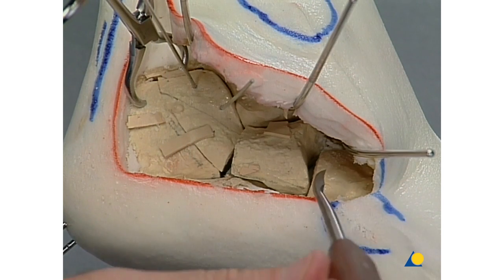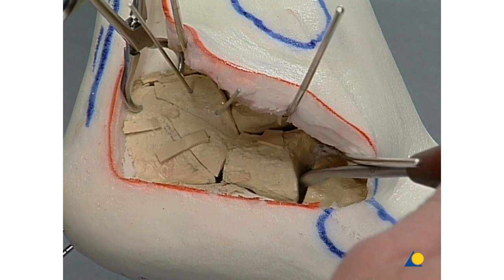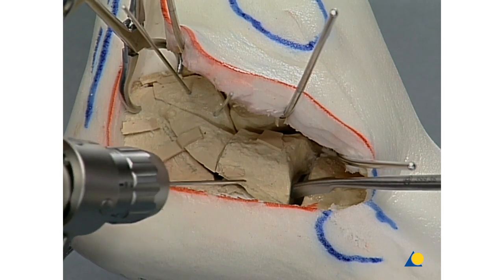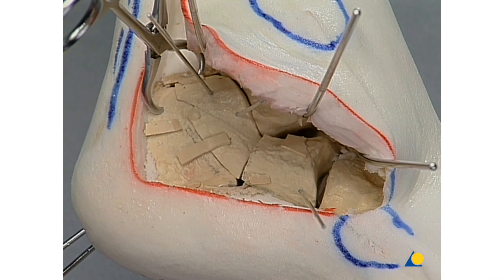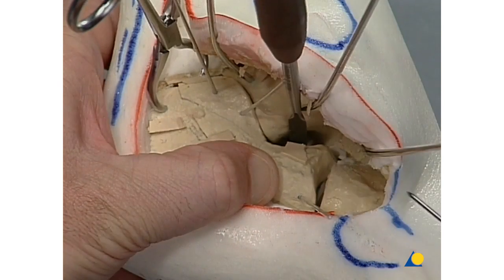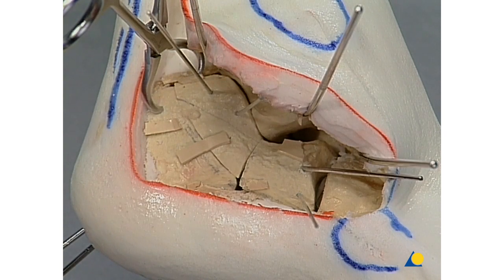The anterior calcaneal process is reduced at the level of the calcaneal cuboid joint with the small periosteal elevator under direct articular visual control. Preliminary K-wire fixation is placed parallel to the articular surface. Reduction of the whole anterior calcaneal process onto the posterior part of the calcaneus is achieved by means of the periosteal elevator, and reconstruction of the tarsal sinus whereby the landmark is the Gissane angle. Temporary K-wire fixation of the anterior calcaneal process to the posterior part of the calcaneus, and checking of the reduction on the Gissane angle.